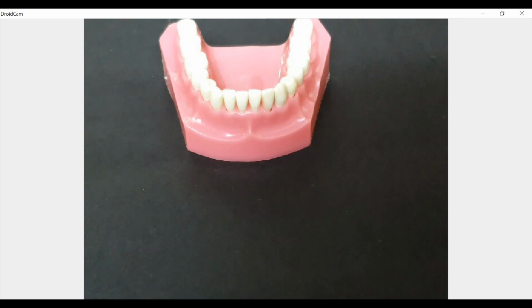Dimensions of the tooth which you are restoring, whether it is averagely sized, whether it is smaller than normal, or whether it is extremely large. That will determine your choice of clamps. Dimensions done, whether they are partially erupted teeth, because if the teeth are partially erupted, then you will not be able to engage the portion below the undercut or the bulge of the tooth, and hence the rubber dam isolation will require special selection of clamps.